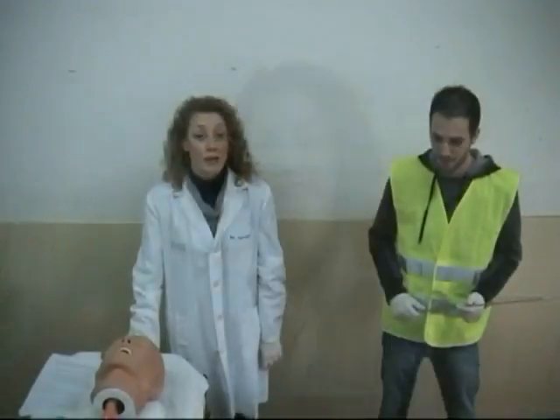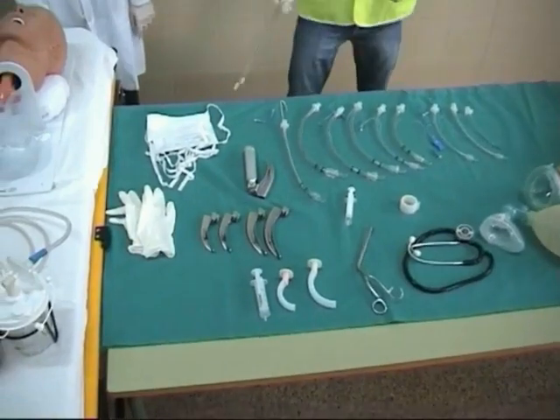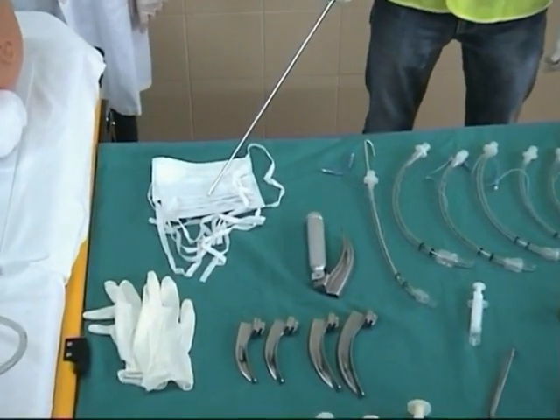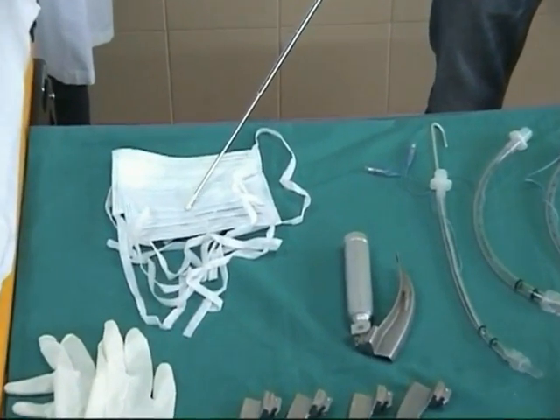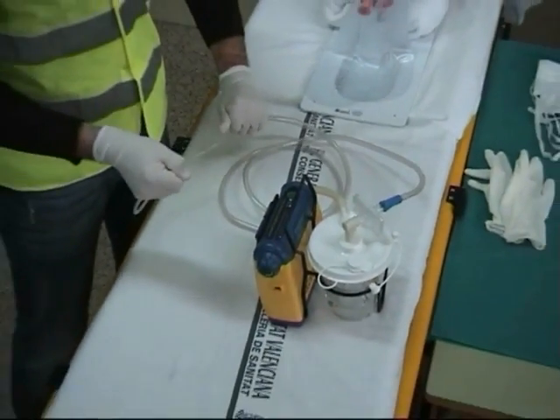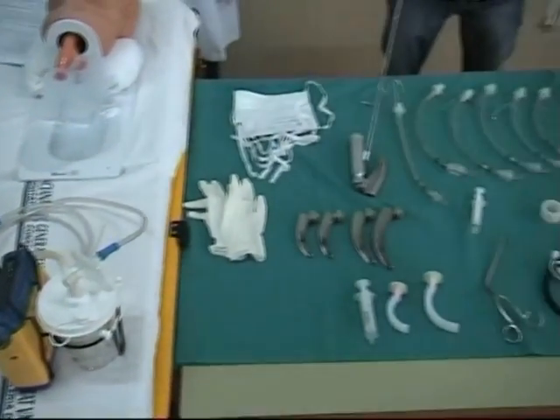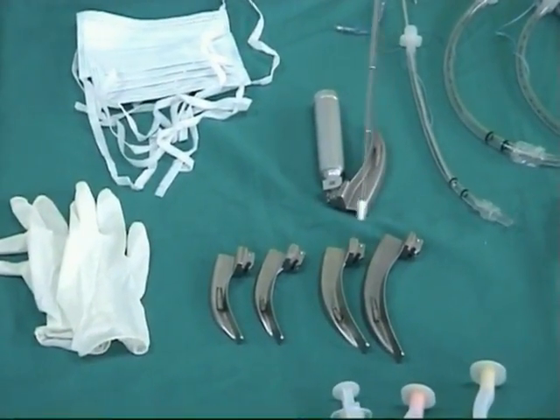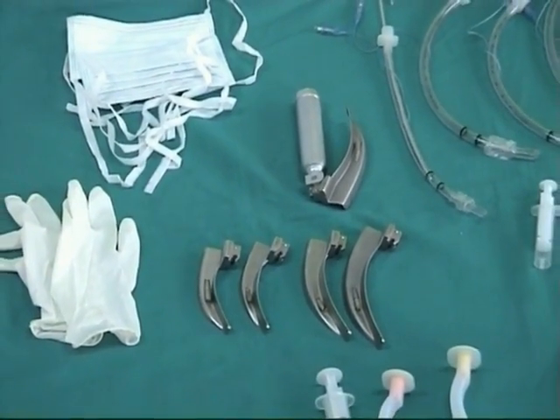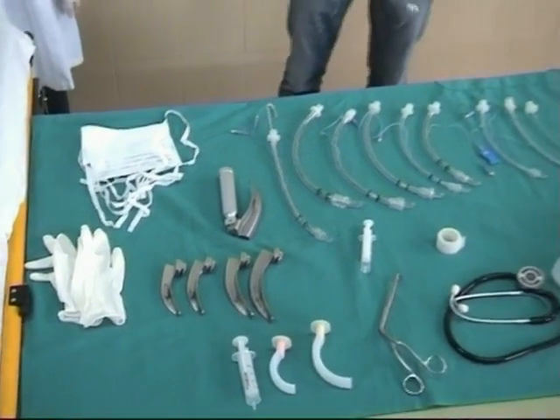The first step is to gather the required equipment, which is the following: gloves, protective face shield, or at least a facial mask, a working suction system, a laryngoscope with appropriate blade. There are two main sorts of blades, curved and straight. In this case, we are going to use curved blade. Endotracheal tube with a stylet.